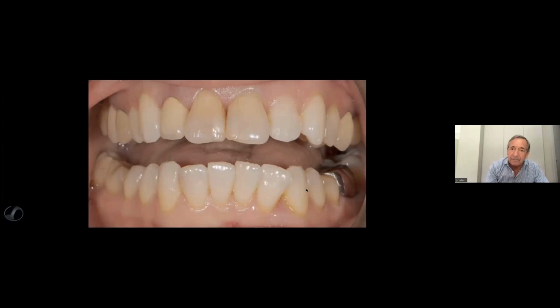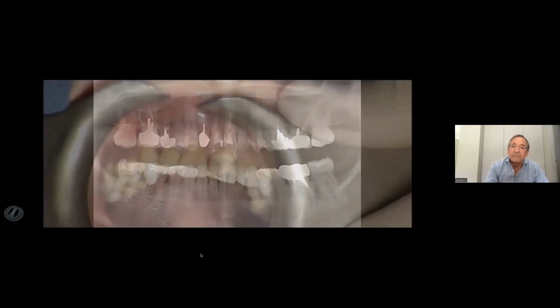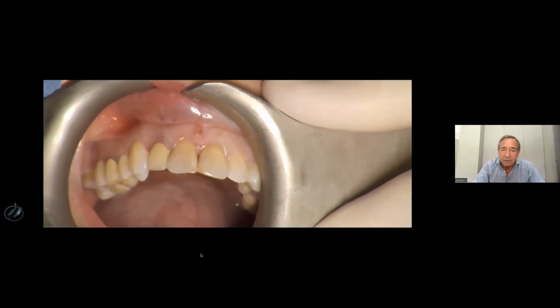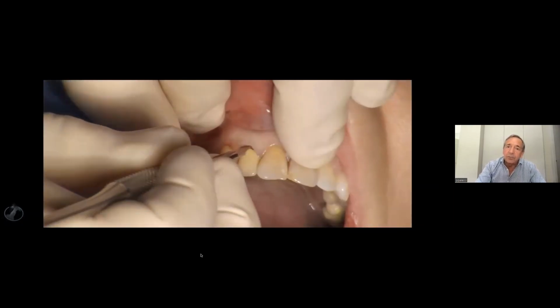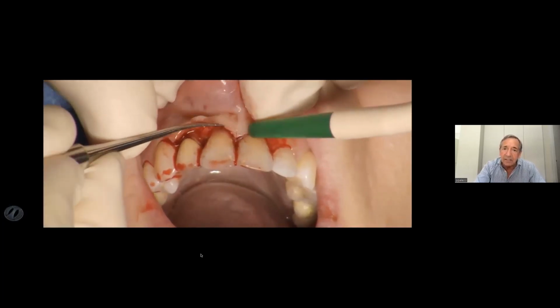Several teeth. Values, remember, will be between 60 to 70. We need to extract those two centrals and the lateral incisor. And this is the case. In the same way, you see I do every time the same thing. In the same way, same simple case.